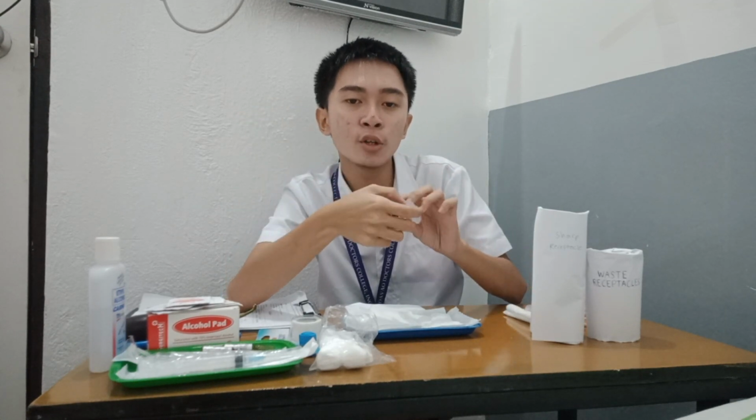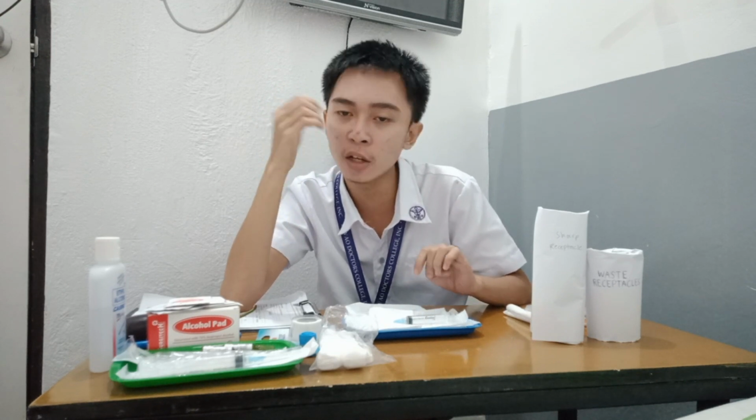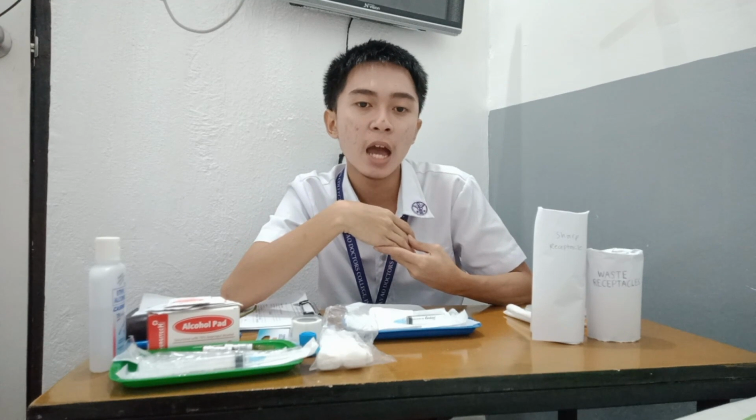Use an ampule opener or a piece of sterile gauze or alcohol wipes between your thumb and the ampule neck, and break off the top by bending it toward you to ensure the ampule is broken away from yourself and away from others. After doing that, we are going to get a gauze or a cotton ball. Hold the cotton ball between the fingers and the neck of the ampule and break the ampule away from you and away from the people, just for caution.